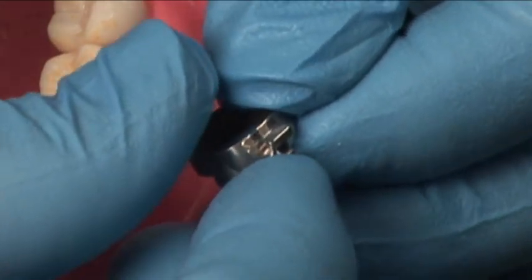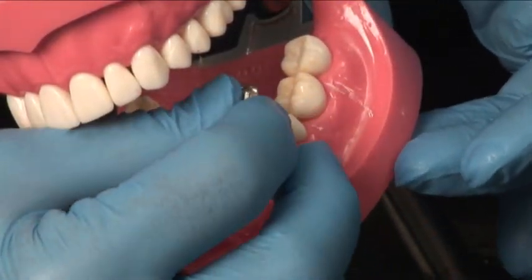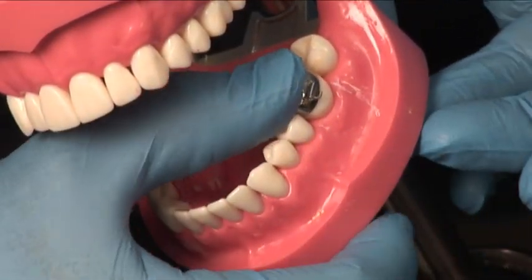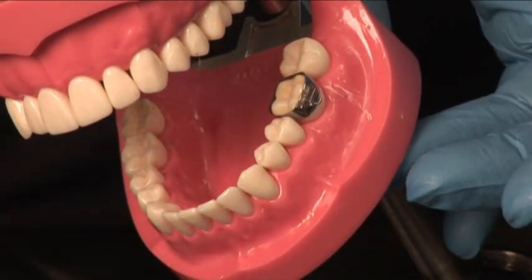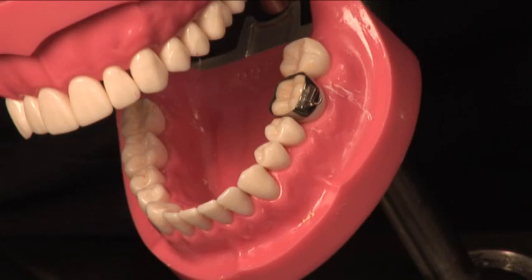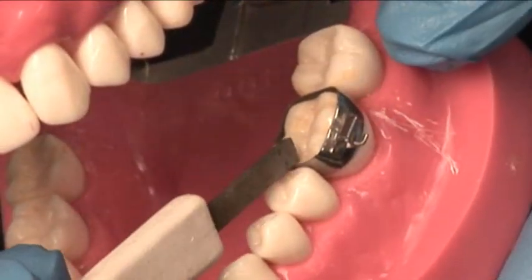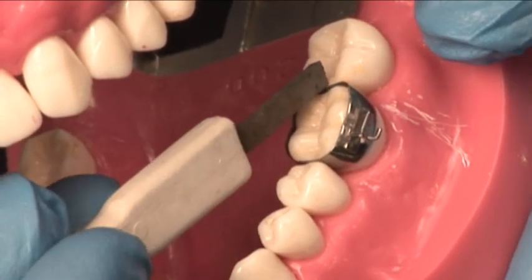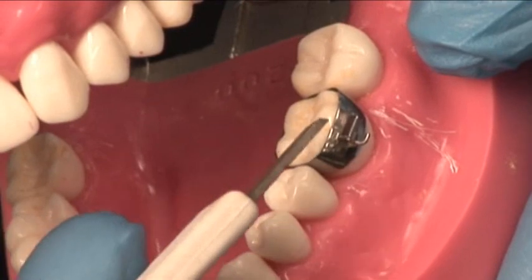One of the things that I do when I put the band in the mouth is I hold it, and I know it's going to be hard for the camera, but I push it down with my thumb between the contacts. Once it gets between the contacts, then I'm going to use a band file, and I'm going to push it down between the mesial and the distal of the tooth.